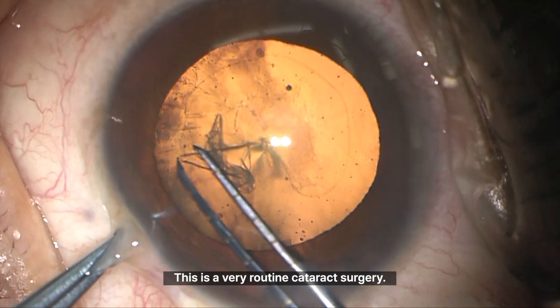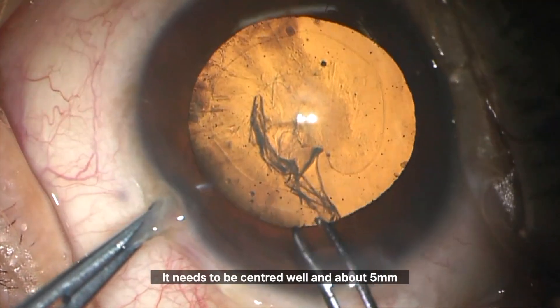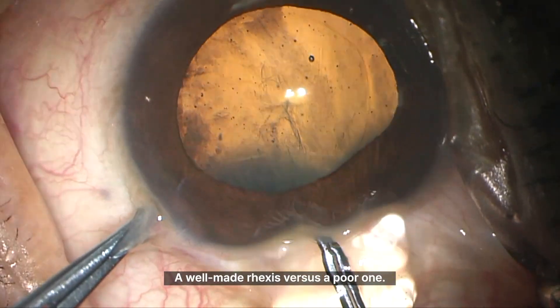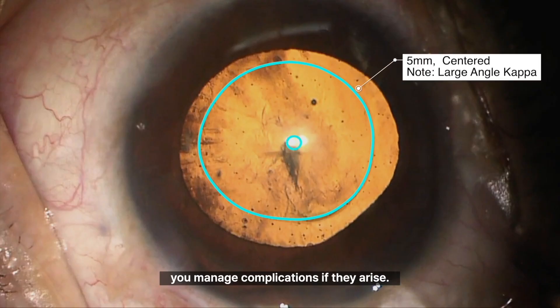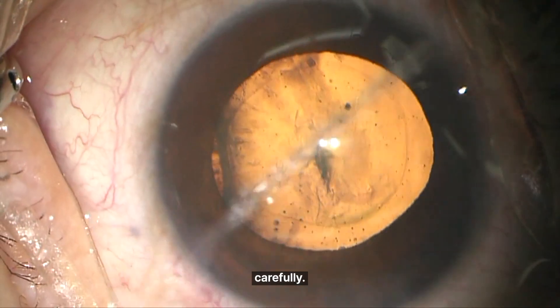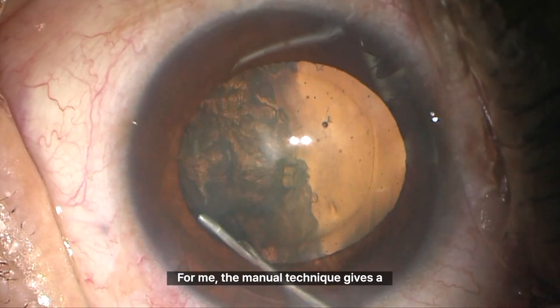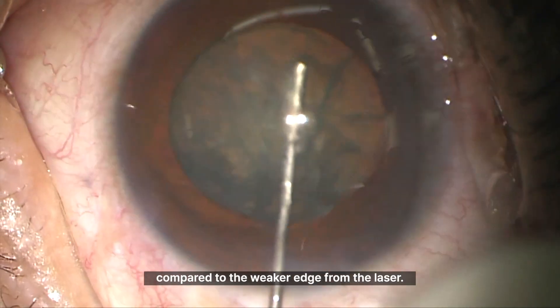This is a very routine cataract surgery. As always, I put a lot of focus on the capsulorhexis. It needs to be centred well, and about 5mm in size — not too large, not too small. A well-made rhexis versus a poor one: the difference is like night and day, both in the final outcome and in how you manage complications if they arise. That's why I take my time — slowly, carefully, almost to the point of being tedious to watch. Femtosecond lasers exist, but I don't use them. For me, the manual technique gives a stronger cut, and I feel more confident with it compared to the weaker edge from the laser.